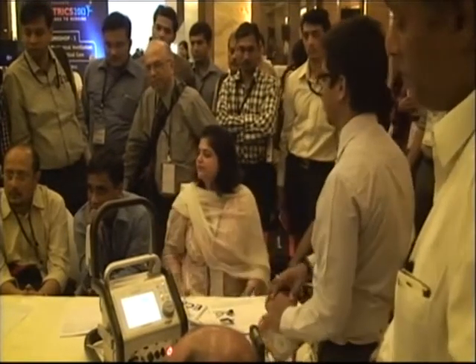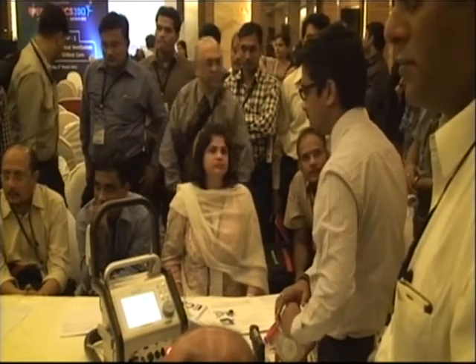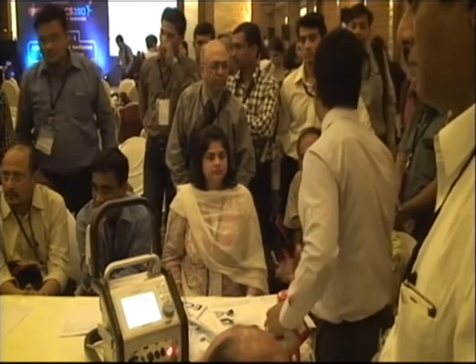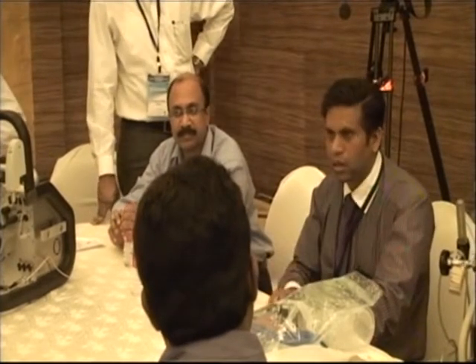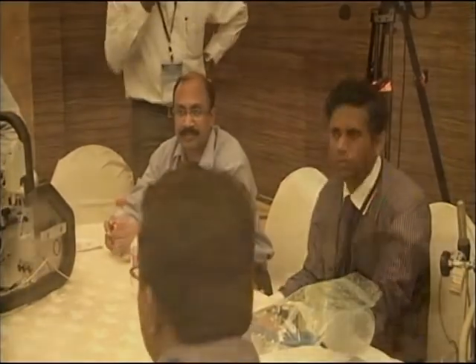and then again it starts functioning. It might take 1 hour, it can take 2 hours. When we decide that it's not going to make it, if by around 2-3 days we are not able to see a good perfusion pressure, we try to give a preload. The heart starts beating once we put on ECMO, say after 1 or 2 hours. But the crux is whether this heart will maintain the perfusion once we start giving it blood. We might reduce the flows by 50%, giving 50% load to the heart, and the heart works. But as we reduce the flows further and give 75% work to the heart, it doesn't do it. If this continues for at least 3-4 days, then probably we realize that it won't recover.